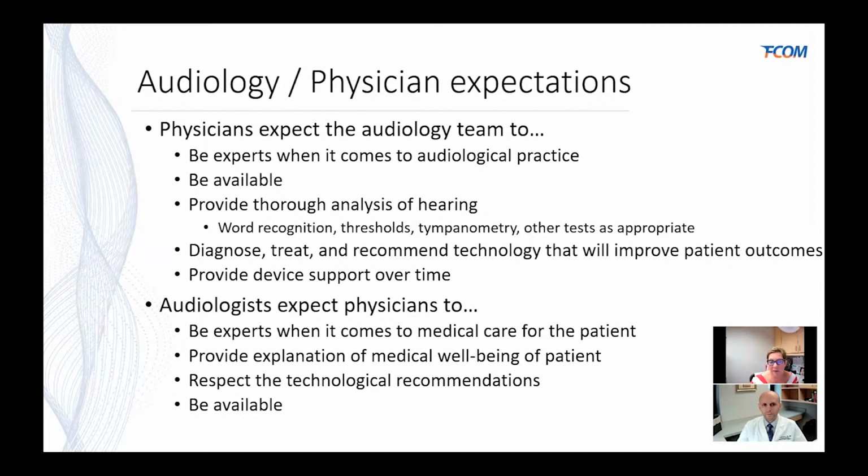their hearing. But likewise, sometimes we have patients who aren't wearing hearing aids because of the nature of their hearing loss. And so, we talk amongst ourselves, like Dr. Gantz said, a lot of times in real time. We'll go over to the clinic and inform the physician of their upcoming cochlear implant evaluation that day. We'll talk to them about the medical history and their outcomes with some of the speech perception testing, and give them an idea about where we think we're going with that patient, whether we do think they're a good cochlear implant candidate or if we don't think they're a good cochlear implant candidate. And then we talk amongst ourselves to develop a plan so that the audiologist can go back and give that patient an idea where they're going and what their next steps are going to be.